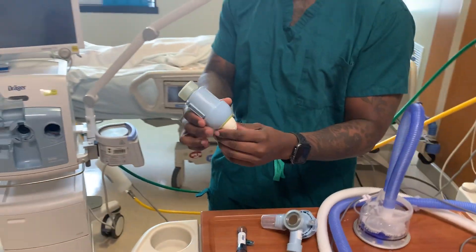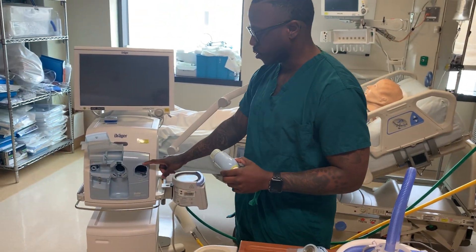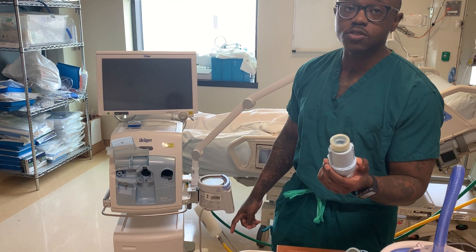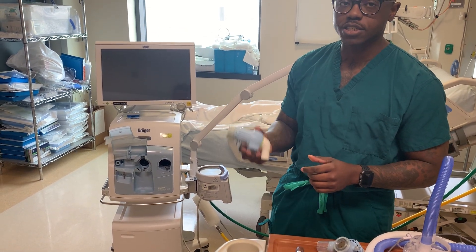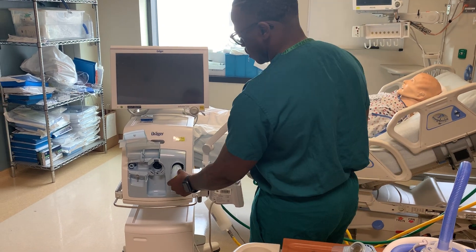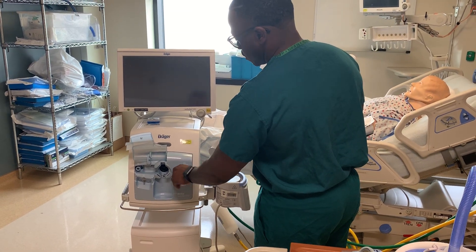This inspiration valve is going to go into the inspiration port. Typically these don't come off — most facilities will not actually remove these, as this is a multi-patient use component. You would just slide that in there, turn it, and hear a click.